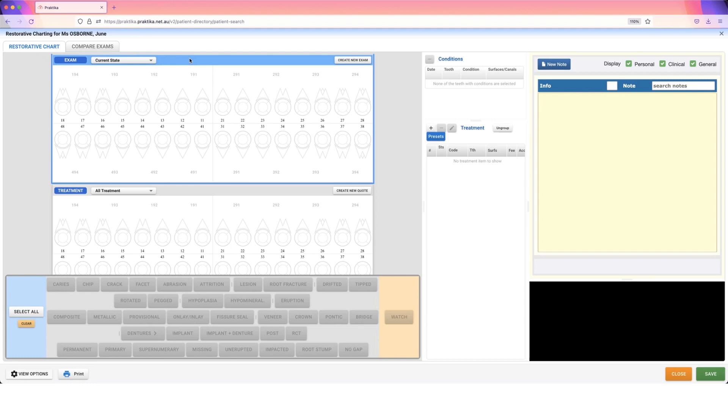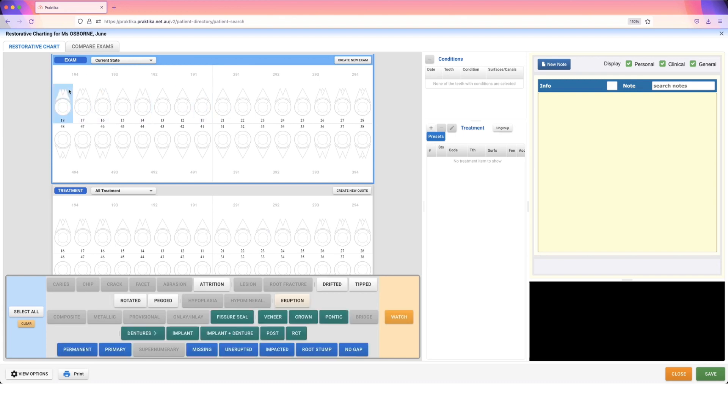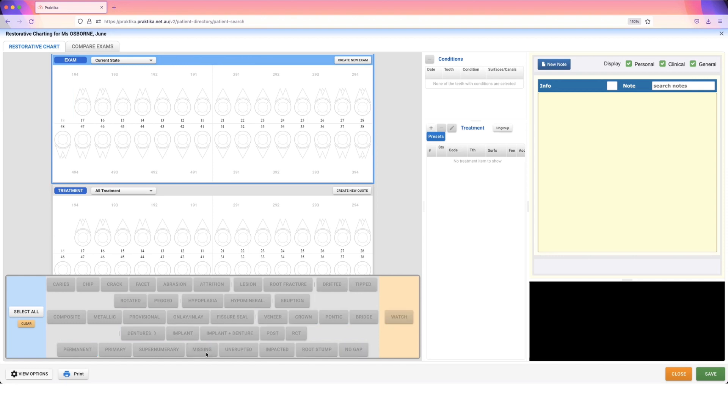Now the first choice that you're going to have to make is: do I want to just chart straight onto my current state? You can do that straight away, so I can select my one-eight and mark that as missing, for example. Or do I want to create a new exam? There's no problem with either way that you want to go about doing this, but personally I would recommend to create a new examination because it makes it much easier to see when changes have happened.